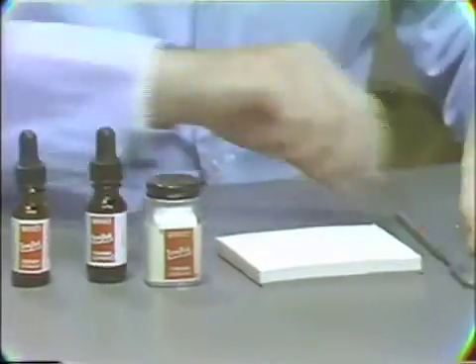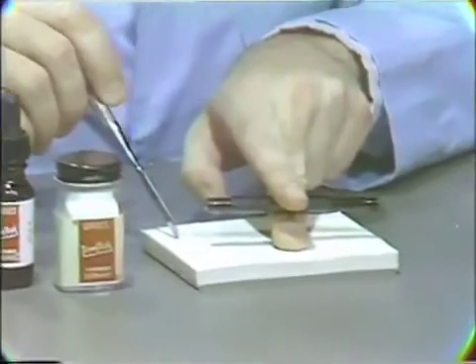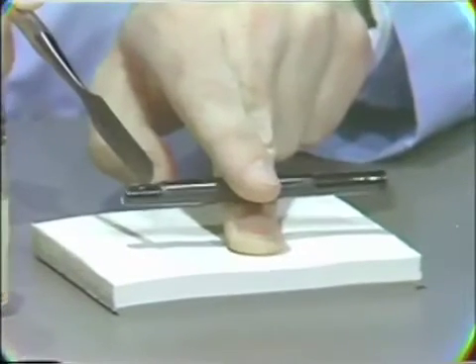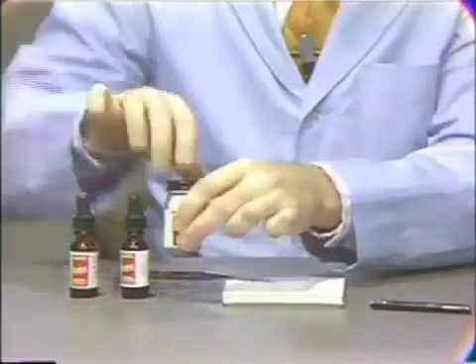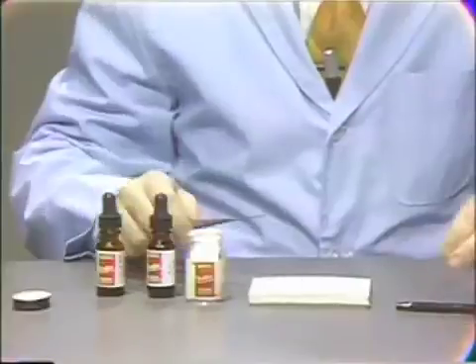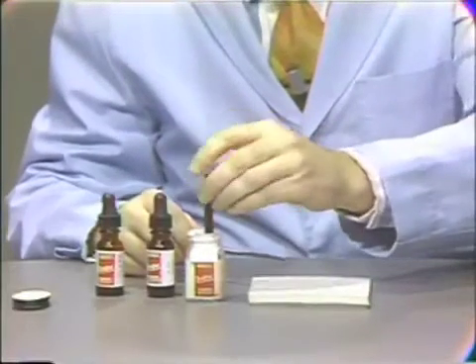In order to dispense the material and get an adequate powder-liquid relationship, we'll use a standard cement powder measure. It has one large end and one small end. The mix should be carried out on a paper pad rather than on a glass slab, because of the problem of the material being extremely sticky and difficult to clean from a glass slab.